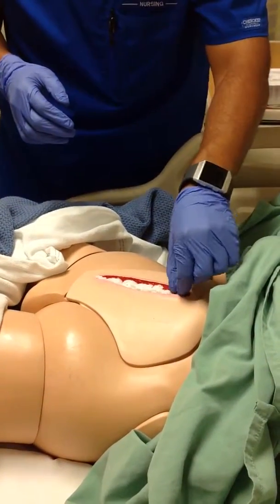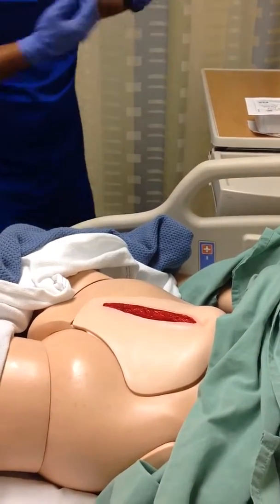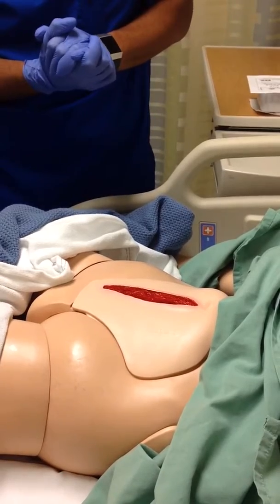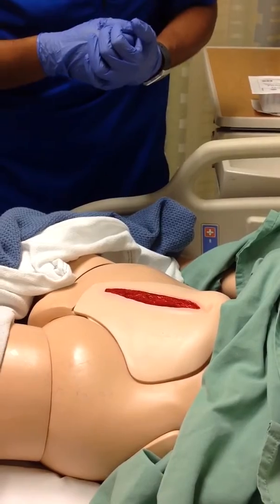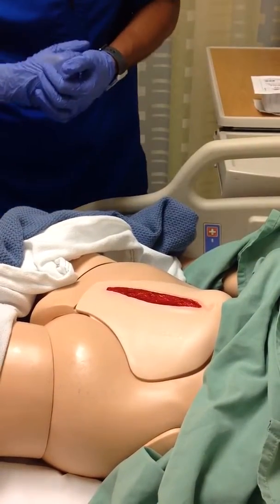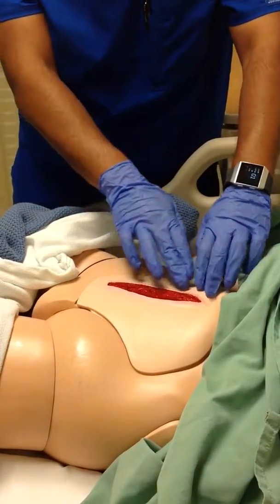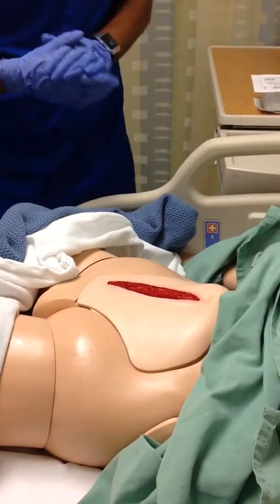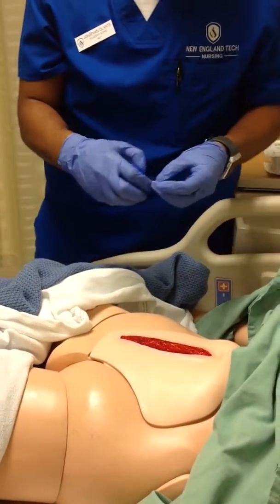I would remove the patient's packing, doing the same thing, analyzing the drainage, at which point I would look at the patient's wound itself, noting for any granulating tissue, necrosis, or slough, which there is none at this point. I would then palpate the patient around the wound site for any blotchiness. There is none. So I would then measure the patient's wound using the measuring tape without actually touching the wound.